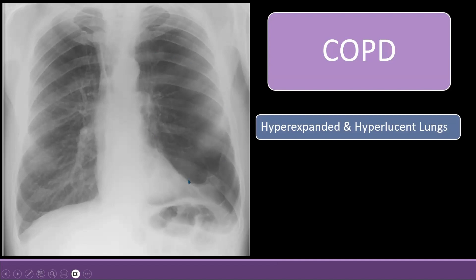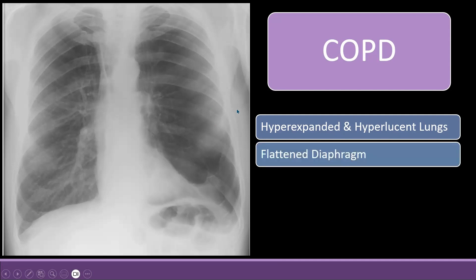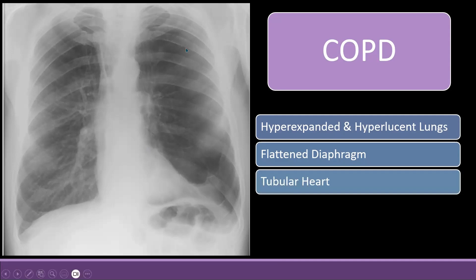Another sign is hyperlucency — the lungs appearing more black than normal, especially visible in the left lung here. The third sign is a flattened diaphragm: because the lung is larger and hyperexpanded, it pushes the diaphragm down, losing its normal dome shape and becoming more flat.